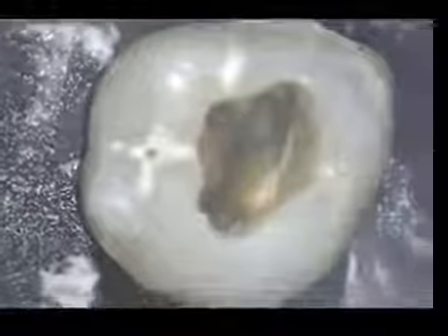I worked the mesial buccal groove of tissue a little deeper to see if the mesial buccal tissue will be one canal or branch off to two or more. Irrigation with sodium hypochlorite helps digest tissue remnants as well as remove any dentinal dust present, giving me the ability to probe the canals with an explorer. Here you see me looking for an MB2 with an 08 reamer.